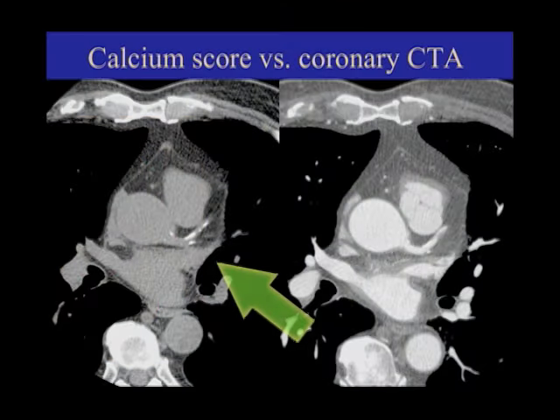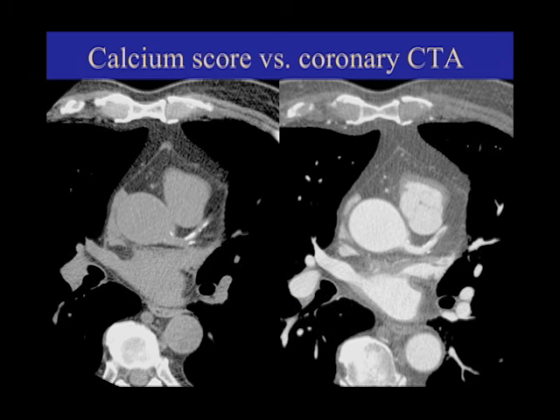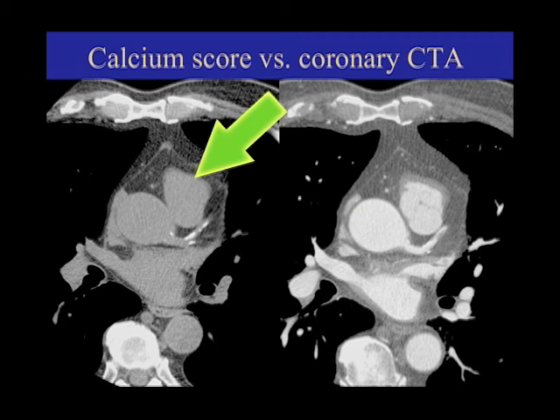This is a calcium score CT. This is a coronary CT. Notice the difference between these two images — what is very white over there that's not white here? Blood vessels, right? We're injecting contrast into the veins.